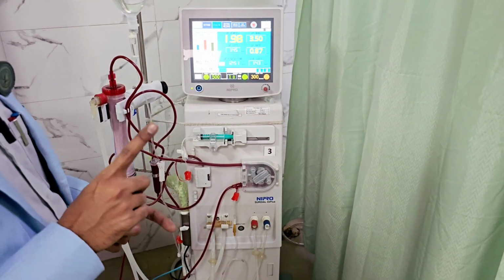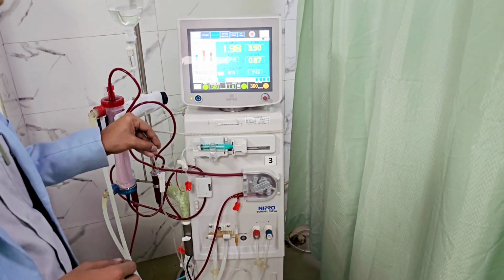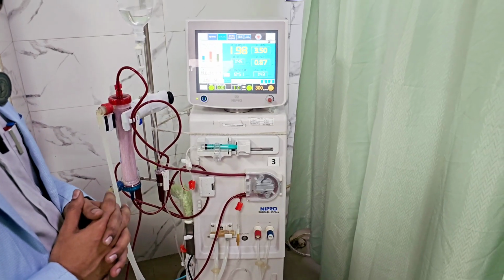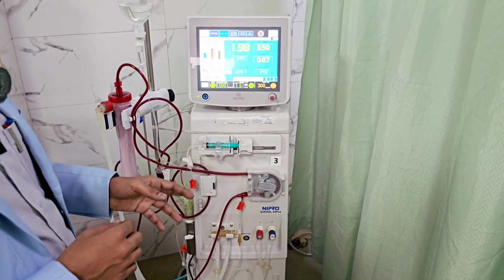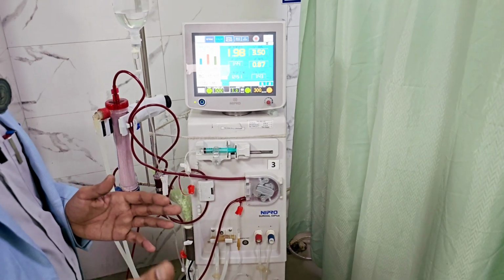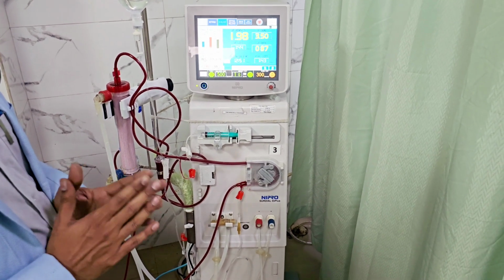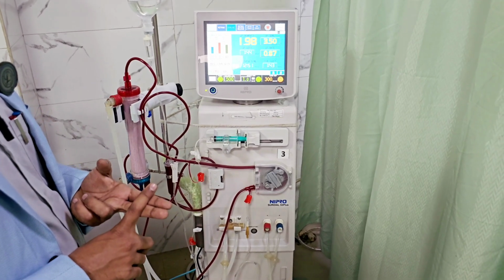The higher the blood flow, the less chance of clotting. If the blood flows at a lower rate in the entire circuit, there is a high chance of clotting. Preferably, you will keep the blood flow on the higher side to prevent clotting. This blood flow is not a single parameter based on which we increase it; other parameters like clearance also have to be taken into consideration. So, net for a heparin-free dialysis, flushing every 30 minutes with normal saline and a higher blood flow is preferred.